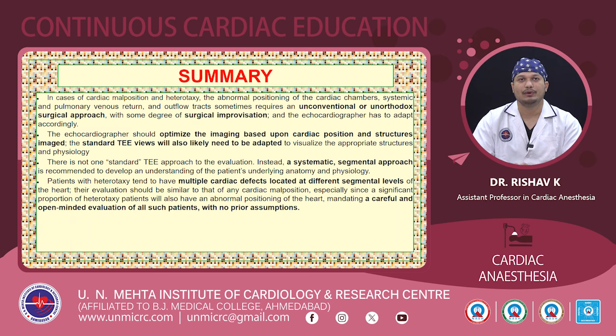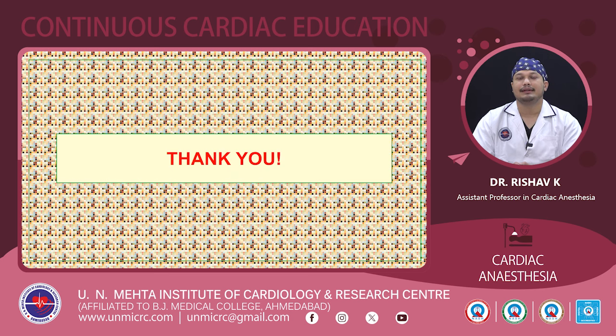physiology. And also, as we have seen in all the preceding images, patients with heterotaxy tend to have multiple cardiac defects located at different segmental levels. That is, they may have defects at the draining veins, at the atrial level, at the level of atrioventricular valves, at the level of ventricles, ventricular arterial junction, and the great arteries as well as the coronary arteries. So, the evaluation should be similar to any cardiac malposition, and a careful and open-minded evaluation should be done in all such patients with no prior assumptions.